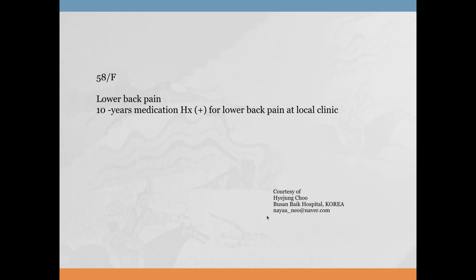Next case: 58-year-old female with lower back pain, 10 years of medication history, and history positive for lower back pain clinic. AP and lateral views are provided.